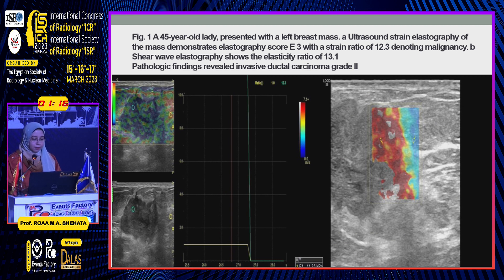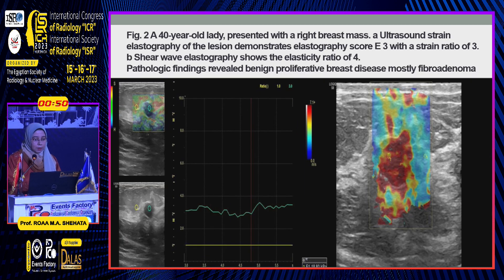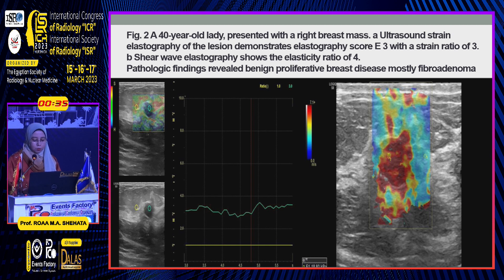This case shows a 45-year-old female patient presenting with left breast lump. The strain elastography shows the mass has an elasticity score of 3, with a strain ratio of 12.3 and shear wave elasticity ratio of 13.1, and pathology revealed invasive ductal carcinoma. In the second case, a patient presented with right breast mass; the lesion had elasticity score 3, mass strain ratio 3, and shear wave elasticity ratio 4, and pathology revealed benign proliferative breast disease, mostly fibroadenoma.